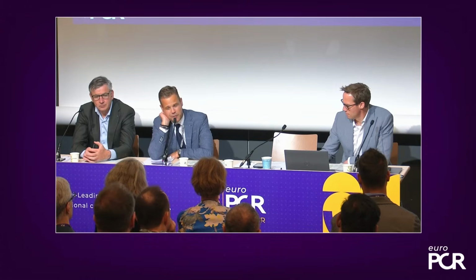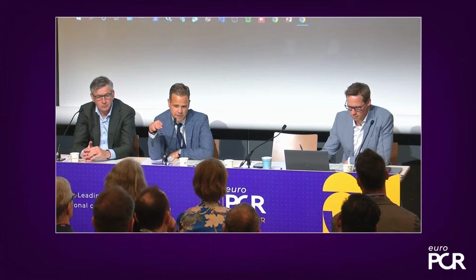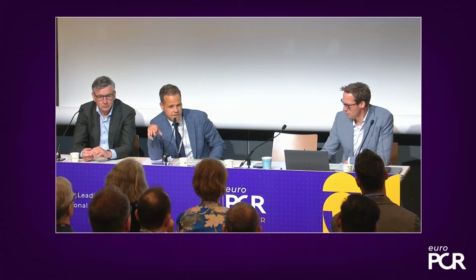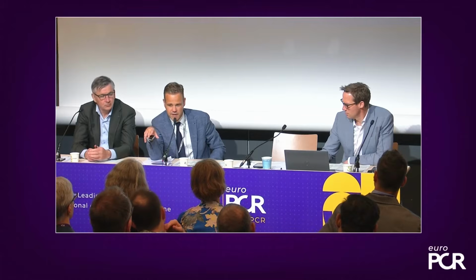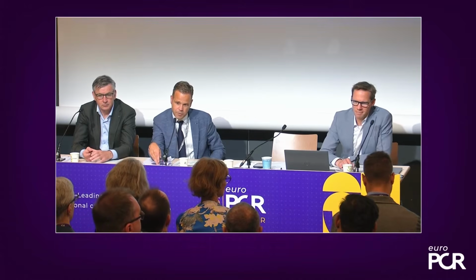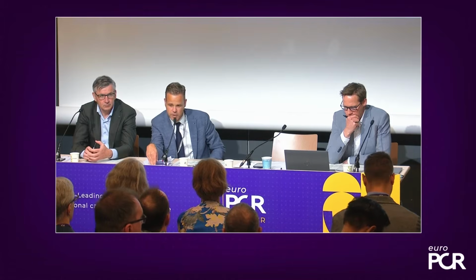In the Netherlands, like I said, I think there are several ways to treat these patients. You have to decide per center what you have access to and what you like. I think there are still quite a few centers that have easy access to anesthesia. They will probably go for 3D TE. But a lot of centers have problems with getting anesthesia. And there are two ways I think they can go. They use smaller probes, to get away from anesthesia.